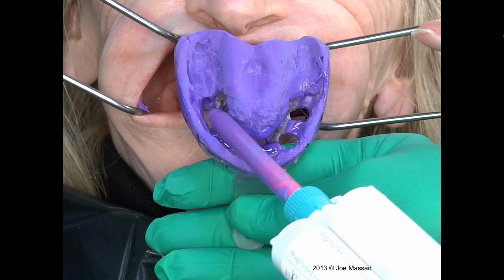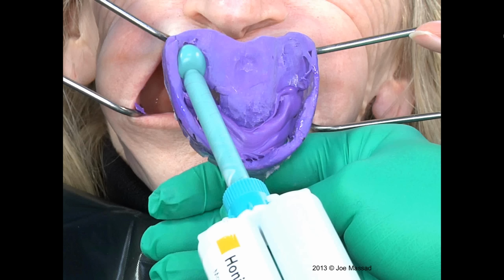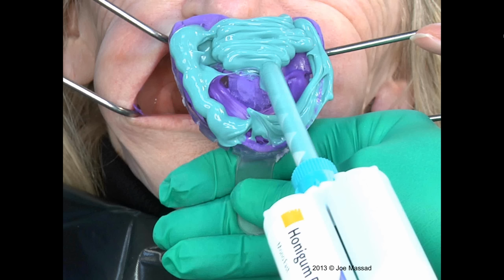And then I'm putting a monophase, and this particular material acts as a light viscosity. It's called a mono, and it's because it doesn't drip until I put pressure to it. And then I'm going to inject around the implant copings with this viscosity. You see nothing's dripping here, but this actually will react as a light viscosity. I then will place the impression in. I have positive stops. I repeat the border molding procedures with the patient.